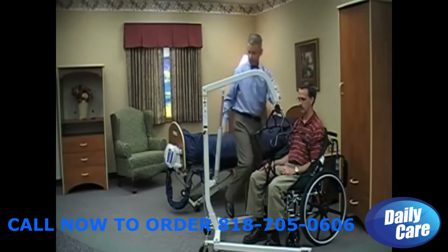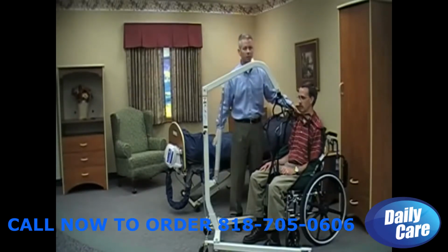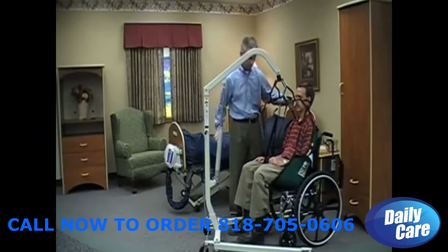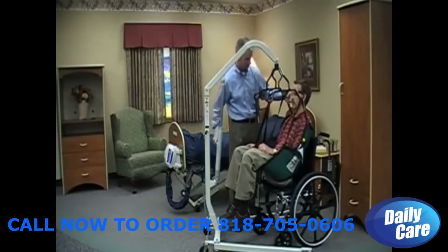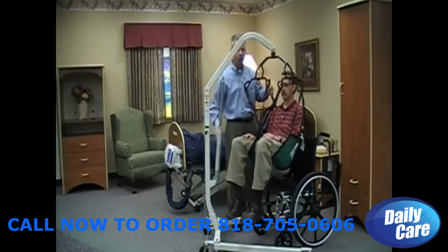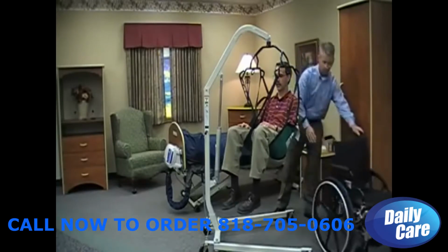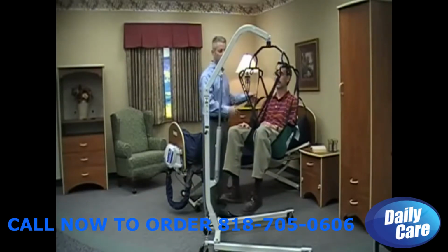After having made my connections, I can simply operate the lift, and you can see I've got my hand here. I'm going to make sure that I've got an idea of where the resident is at all times and continue to make my lift until I've lifted them free of the chair. And after having freed them of the wheelchair, I can position them however needed, pivoting them so that we can transfer to a bed. We can remove the wheelchair, and then we can complete our transfer by simply wheeling them to the bed, positioning them, and lowering them down.